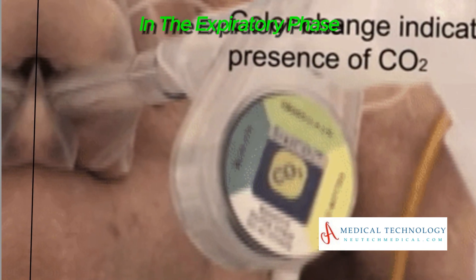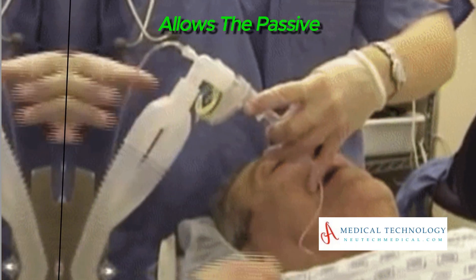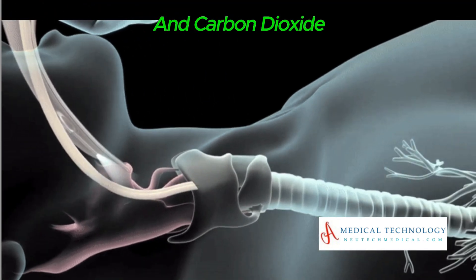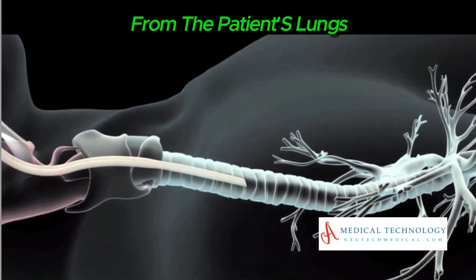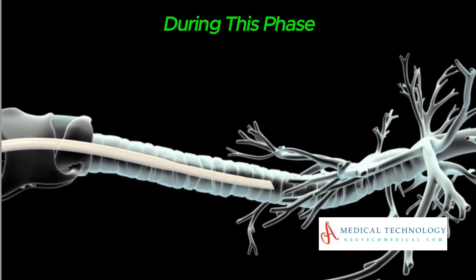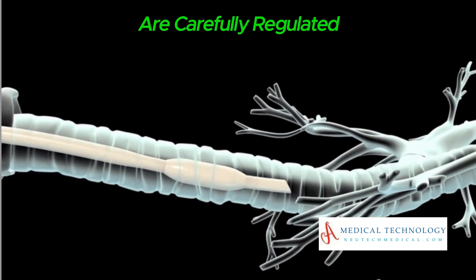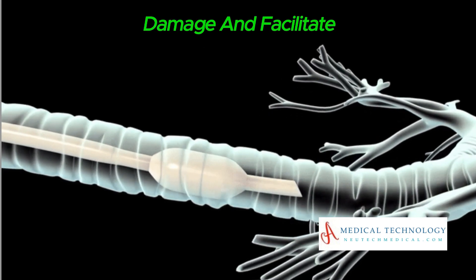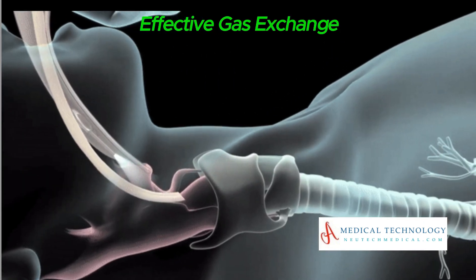In the expiratory phase, the ventilator allows the passive release of air and carbon dioxide from the patient's lungs. The rate and pressure during this phase are carefully regulated to prevent lung damage and facilitate effective gas exchange.